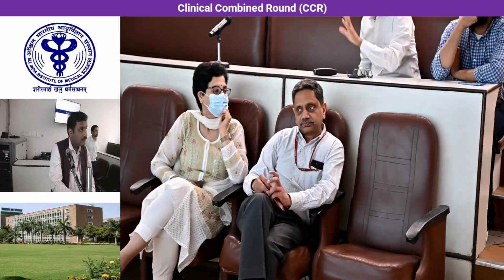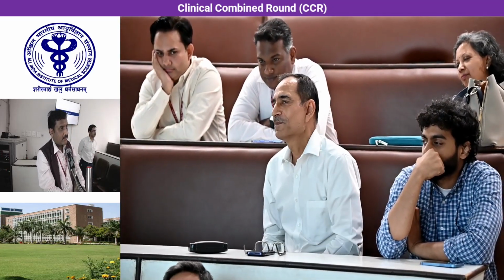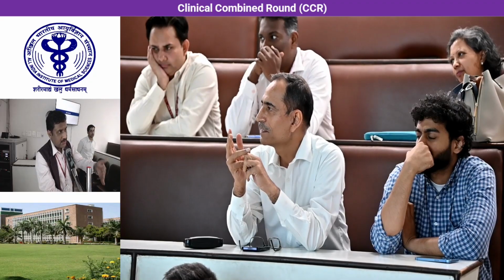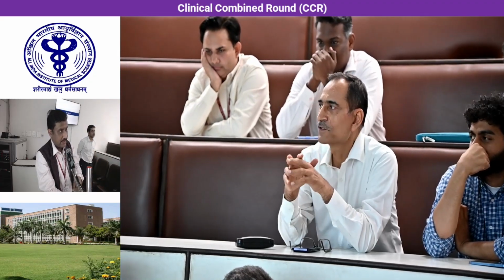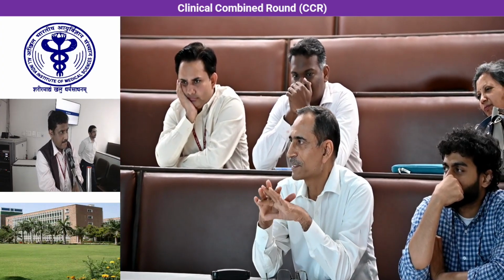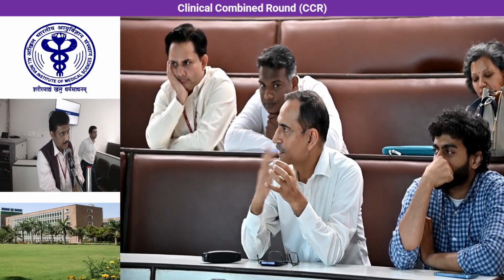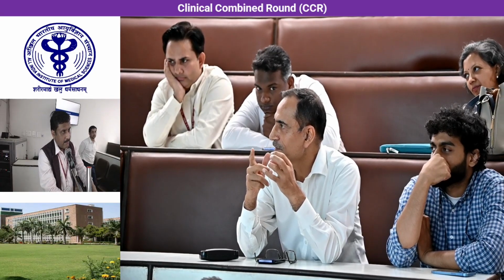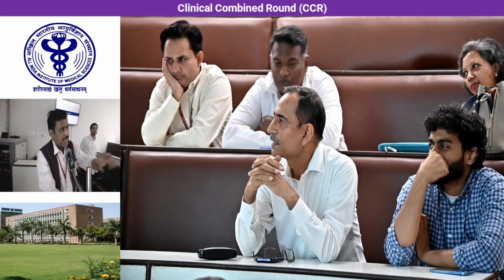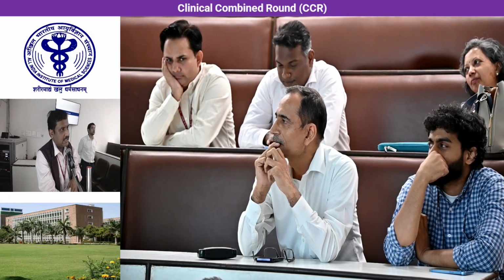For the radiologist also, looking at the intraoperative navigation through all those steps is very engaging. First, I had a couple of things to ask you. What was the operative position of the patient? The patient was in lateral position, left lateral, right side up. Even though surgically it was done with a lot of finesse, eventually, as I understand, it led to prolongation of surgery time. Is that right? Because it took almost 9 hours. By 6 o'clock we finished. Usually an IVC thrombus, if you had done it by open, I agree, maybe you would have finished by 3:30. So it took another 2 hours maybe in this case.